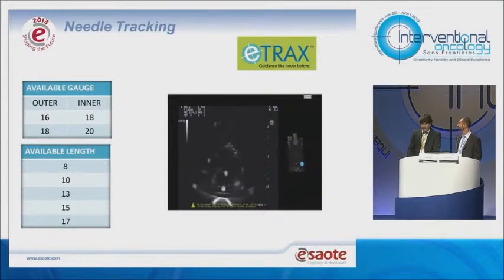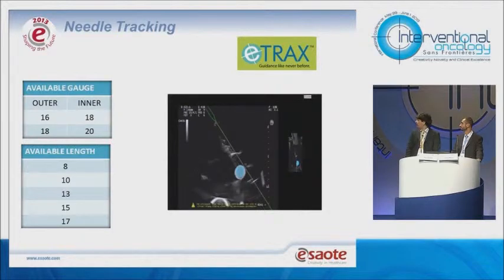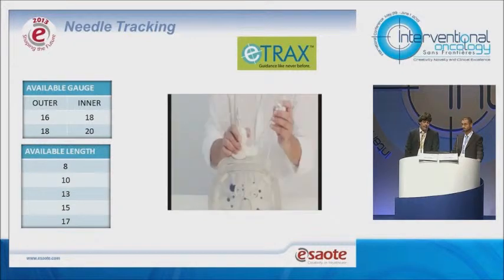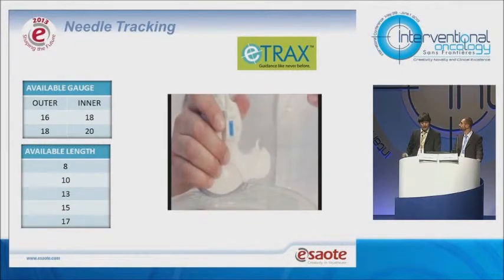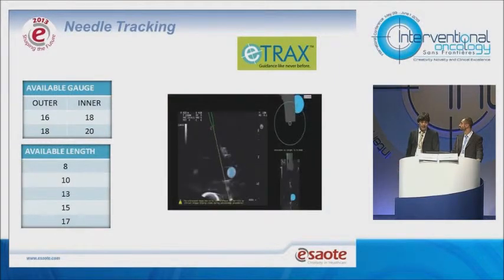In this case, we have access to our target, where we can put inside either a biopsy device or even perform laser treatment. Unfortunately, this channel is not big enough to allow other kinds of therapy like microwave or radiofrequency, also because this tool is metal and this can affect the treatment. As you can see from the video, by moving the needle outside the patient, we can understand in advance what the real trajectory will be and select the best path to reach the target.